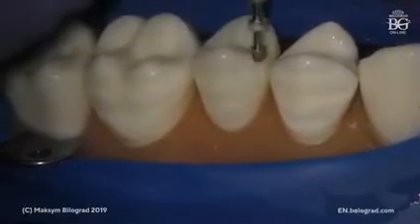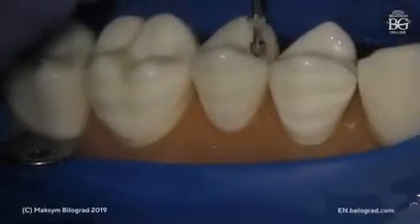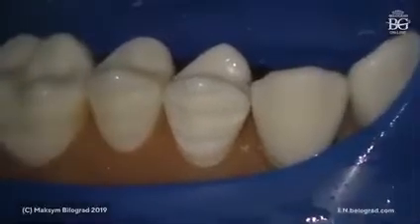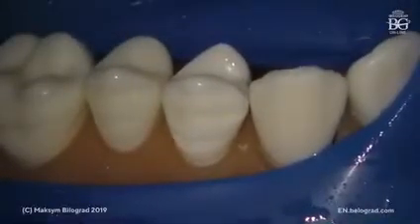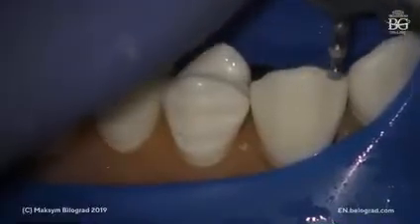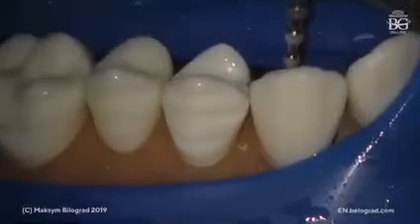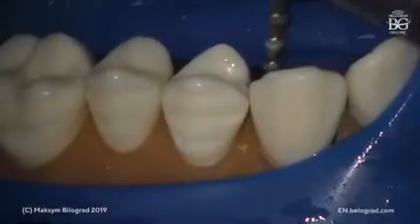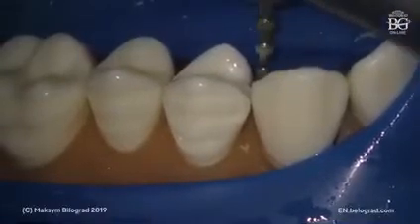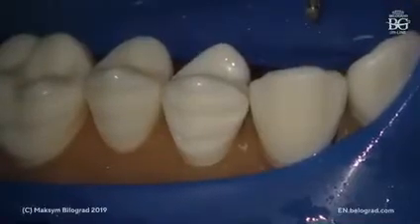Basically, we will do butt joint over a buccal cusp, and the technique of preparation for this partial coverage is the same as, for example, when we prep a canine for classic veneer, when you just make grooves on the incisal area and then you join these grooves with another burr. So we are not preparing anything from palatal side. We are not doing any bevel. We are not doing any chamfer or shoulder from palatal or from lingual side. We just do really classic butt joint.